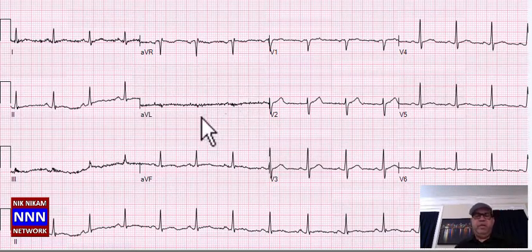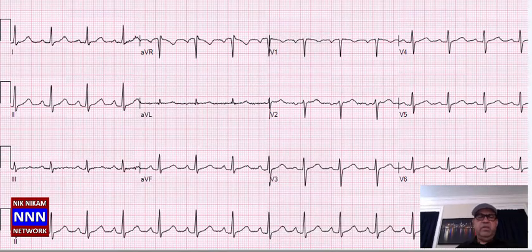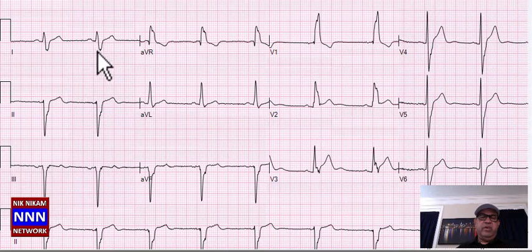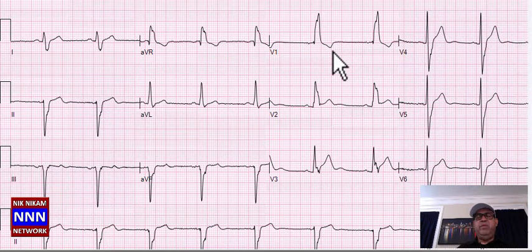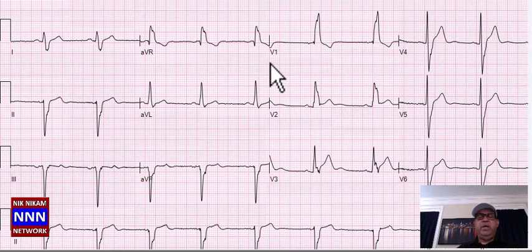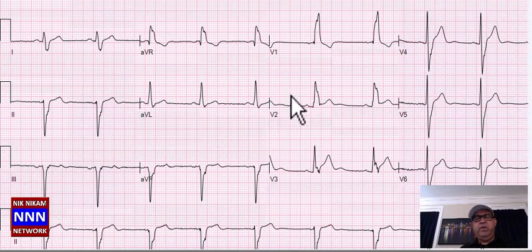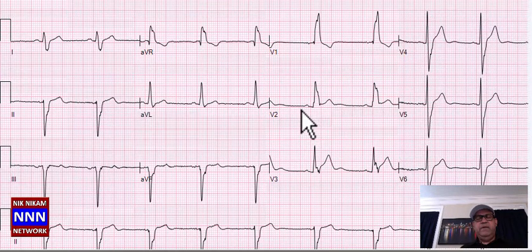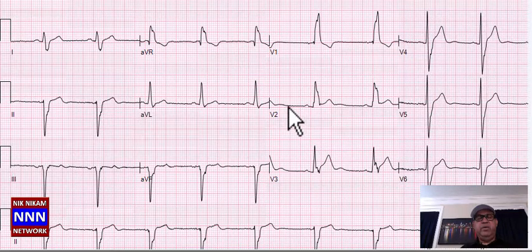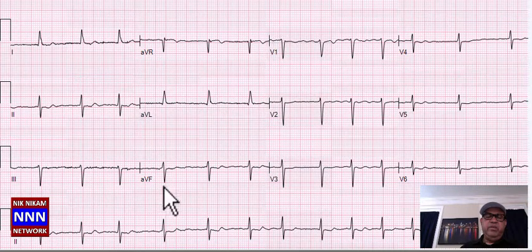Sinus rhythm with non-specific ST-T changes throughout, nothing really significant. There is a slurred S-wave suggestive of right bundle branch block — also RBBB in V1, V2, and AVL. Left anterior hemiblock, left anterior fascicular block, right bundle branch block — and sinus bradycardia.